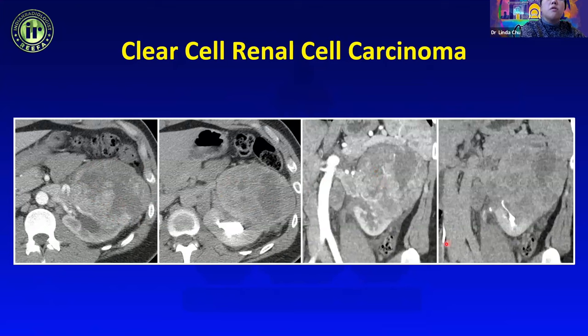When thinking about a fat-containing retroperitoneal mass, the differential includes angiomyolipoma, renal cell carcinoma (with intracellular lipid rather than macroscopic fat), retroperitoneal liposarcoma, and adrenal myelolipoma. To distinguish these, look for the claw sign — with angiomyolipoma, there is a defect in the renal cortex with the fat-attenuation mass mushrooming out of the kidney, confirming renal origin.